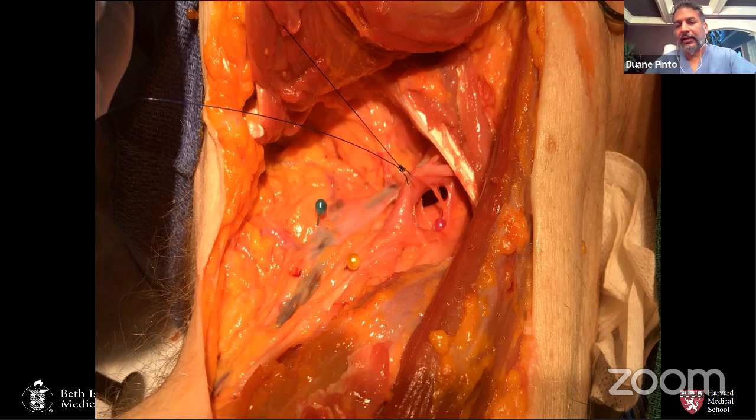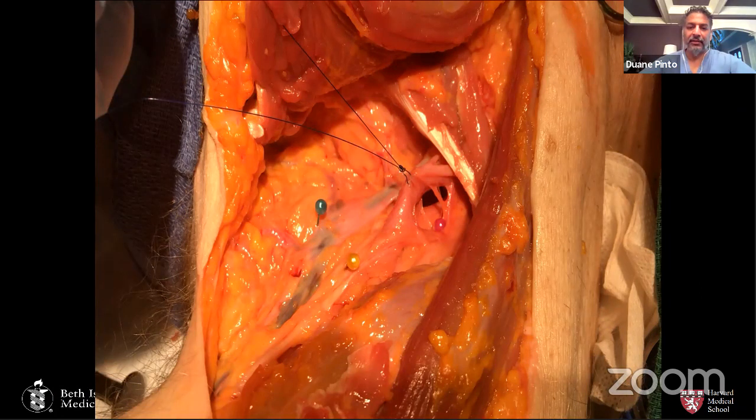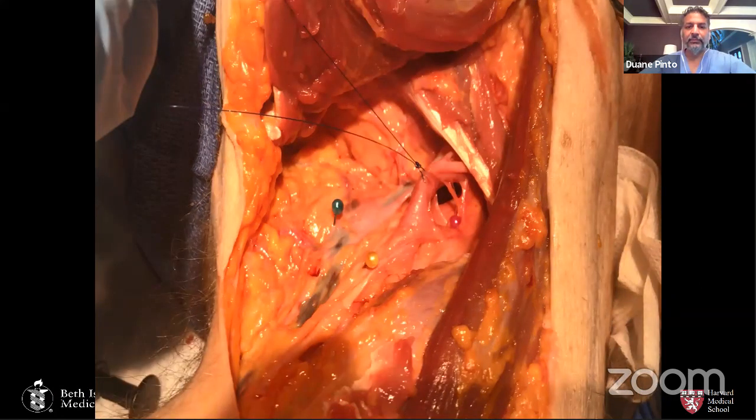Incidentally, as I mentioned, this was the axillary artery. This is after removal of the sheath. So that's another thing to know, is that in a nice artery like this, a non-diseased, non-calcified artery, the artery will often recoil, and often the sheath arteriotomy size is much smaller after removal of the large bore sheath. Okay.